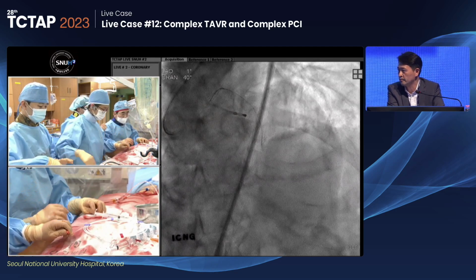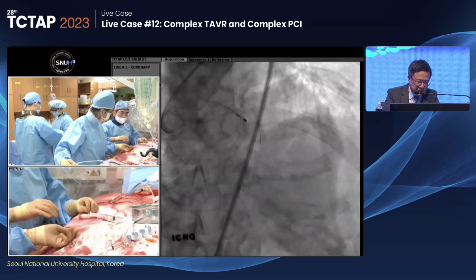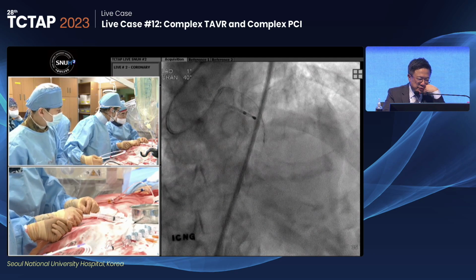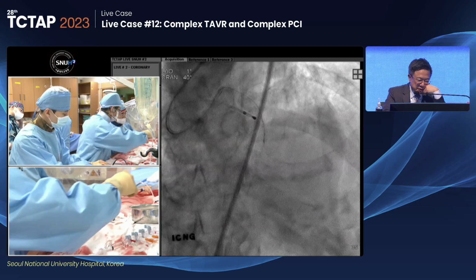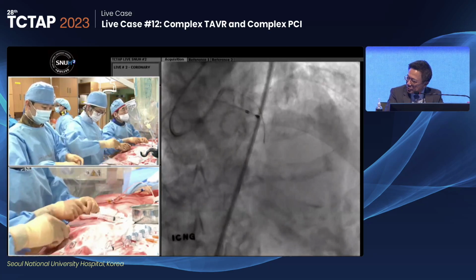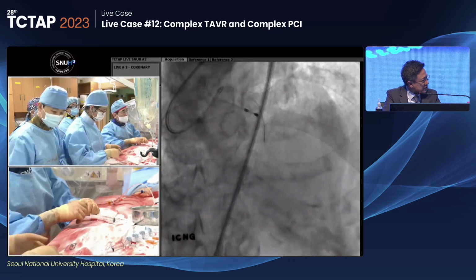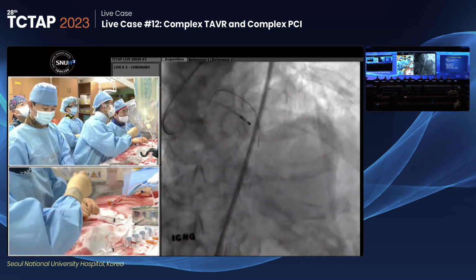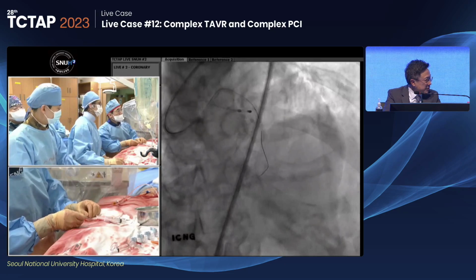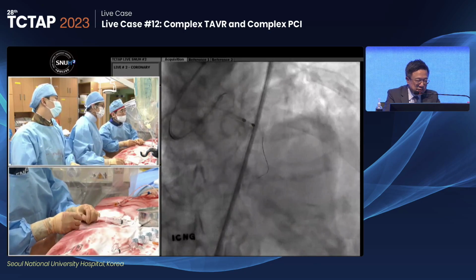So we pre-treat, a lot of times with intracoronary nitrate, trying to at least improve the microcirculation. For the right coronary, if you have a short one, we don't use DCB in clinical practice, we have it in research, but they're relatively long. I'm not sure how short a DCB is available in Hong Kong. Oh, we have the 15 and 20s. Because 20 may be even too difficult, but I think a DCB would be the right choice, using a GuideLiner to go down and just treat it.